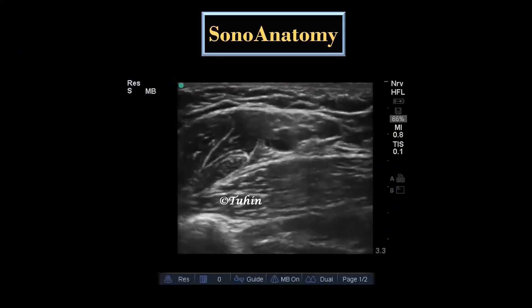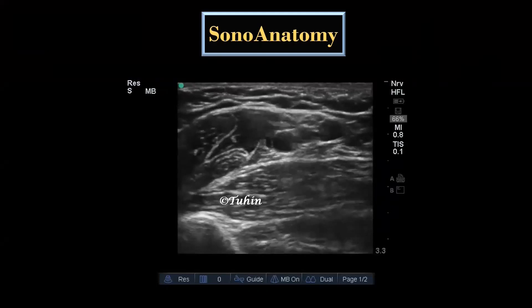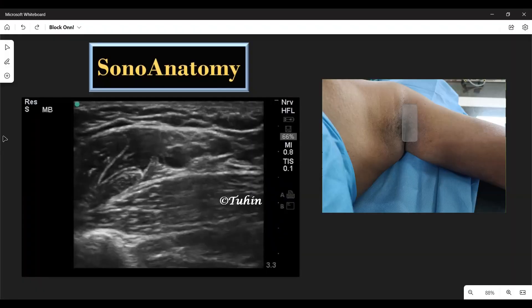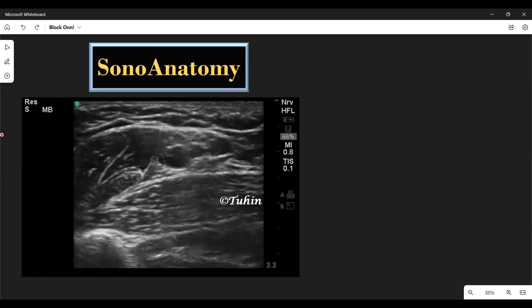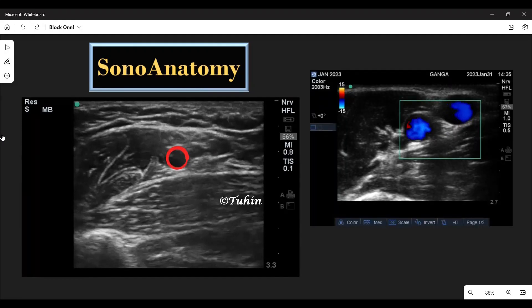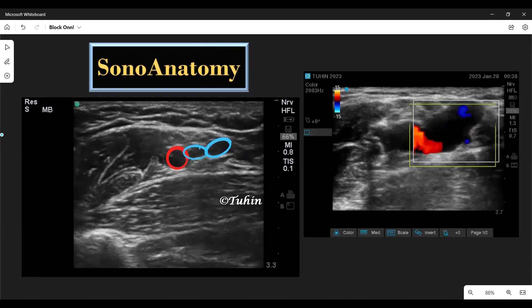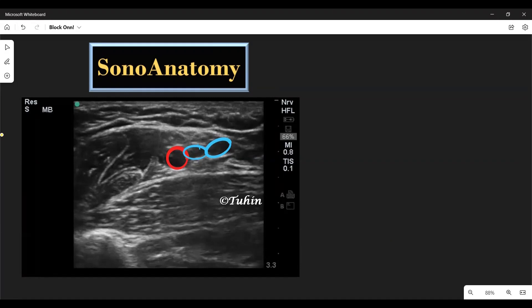Before watching the block techniques, let's have a quick look at the relevant sonoanatomy. The probe is placed in transverse orientation at the lateral border of the pectoralis major muscle or at the junction of the body and the arm. The pulsatile axillary artery is visualized, and on easing the pressure of the transducer, the axillary veins are visualized. It can be single or multiple axillary veins.